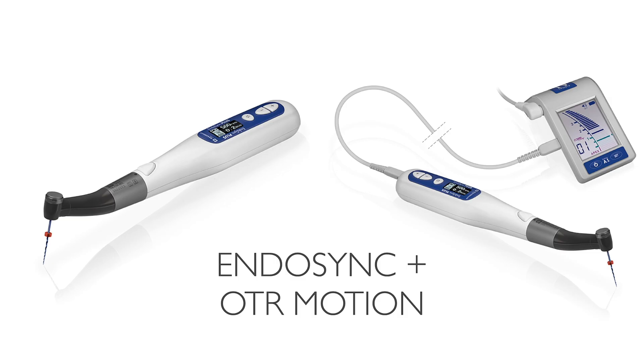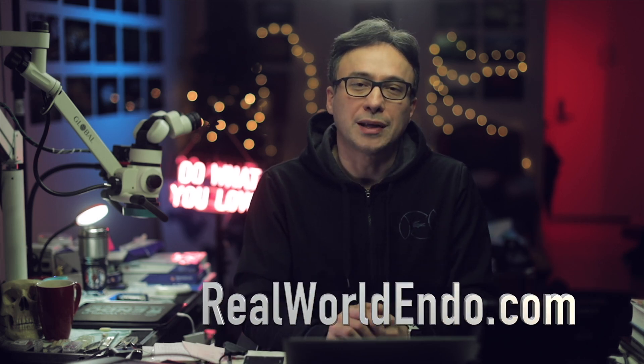The Endosequence Blend protocol is a robust sequence of files that allows you to divide canals into small and large categories, using a combination of files to clean the coronal half, then the apical half, and then blend the two together. Combining this system with the Endosync or Endosync Plus handpieces set at 500 rpm and an OTR torque value of about 0.2 to 0.6 Nm makes this a very efficient and safe instrumentation system. Give this technique a shot and send me an email or drop a comment with any questions at RealWorldEndo.com or on social media.